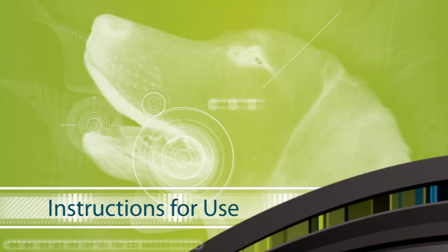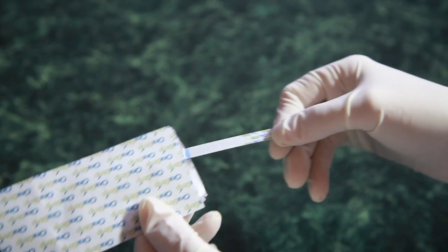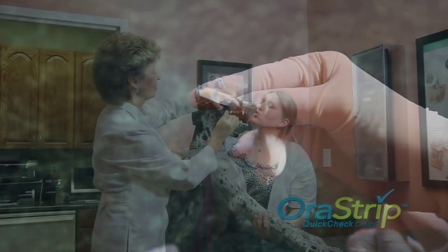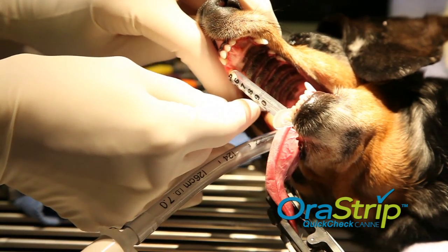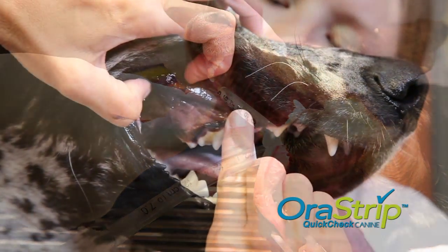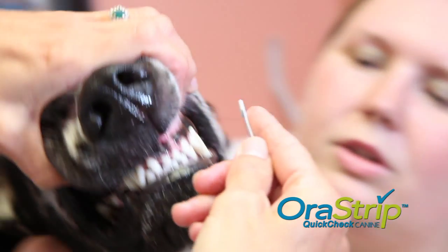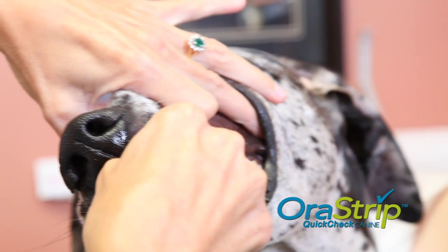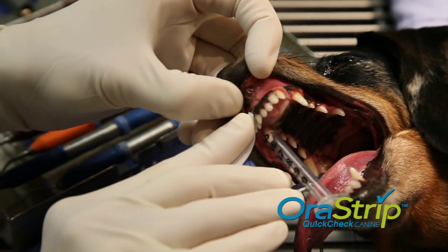Using OraStrip is simple. As you remove OraStrip, be careful not to touch the pad at the end, as it may contaminate the results. OraStrip can be used on a dog while awake or anesthetized. Lift the dog's upper lip, and while supporting the pad end of the test strip with the index finger, gently glide the pad against the entire maxillary buccal gingival margin. The pad should gently glide along the gingival margin so as not to cause bleeding, which will interfere with the result. Excessive pressure on the gum can dislodge plaque, which can also obscure the test result.